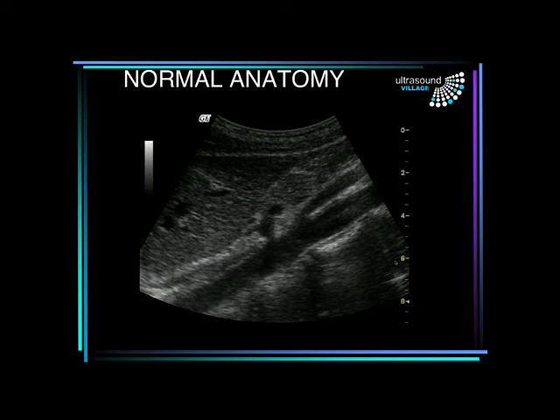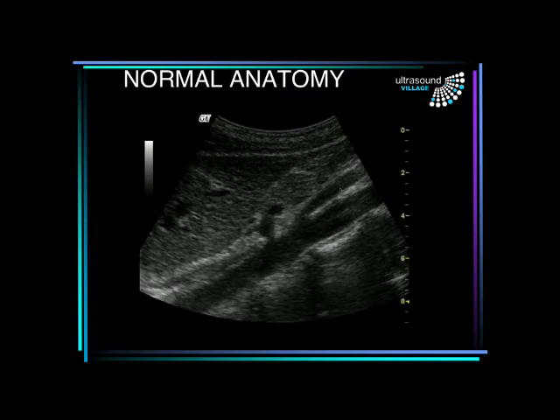Here is an image showing the normal anatomy in the longitudinal view. We have the scalloping of the vertebral bodies and can even make out the intervertebral discs. We have the left lobe of the liver at the top, and here a long tubular structure with anterior branches — this is the celiac axis, and this is the superior mesenteric artery. You'll see this in young thin patients and sometimes older thin patients, but in somebody with a lot of abdominal pain and gas, you usually won't see these vessels, so you can't always use that as a criterion.